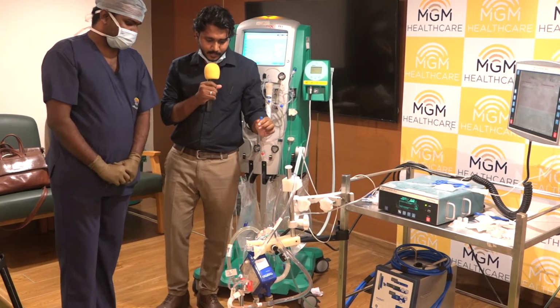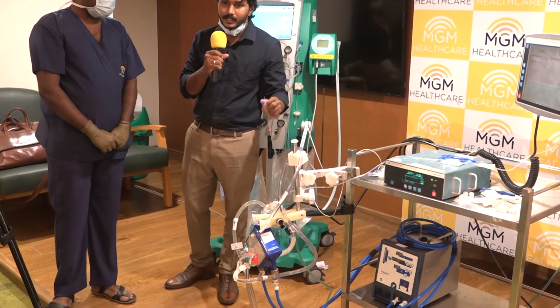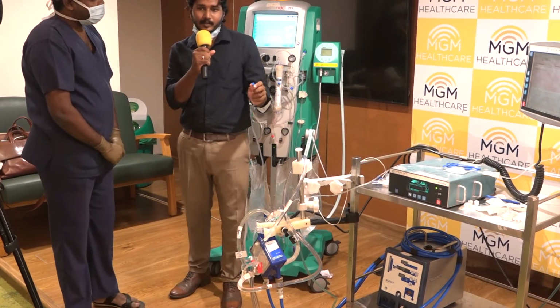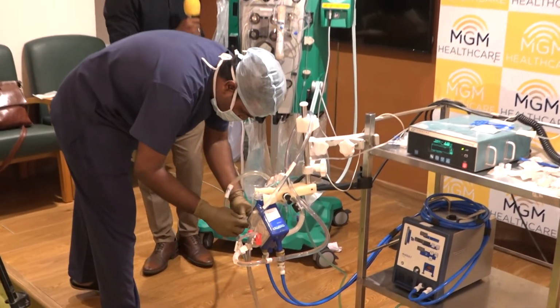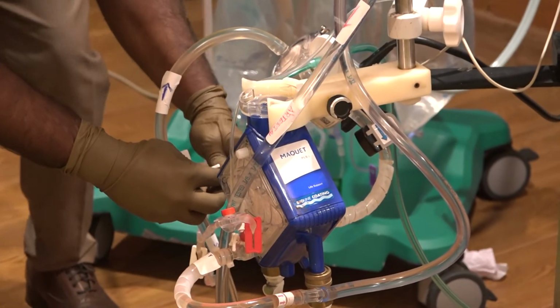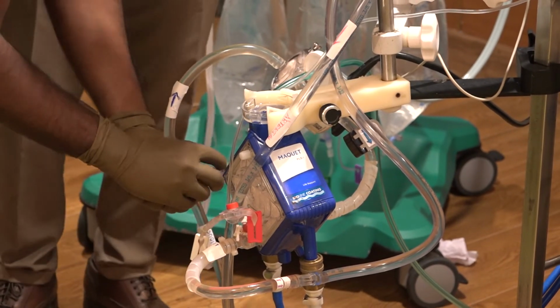The CRRT output line, or return line, we call it the venous line. CRRT output should be connected to the negative pressure side of the ECMO circuit, that is pre-pump. CRRT output will be connected to the pre-pump or negative pressure side of the ECMO circuit. When we do these things, we cannot avoid the alarms completely, we can't say that there will be no alarm, but we can minimize the alarms.